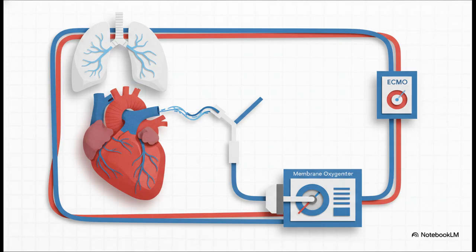In this hybrid setup, what we do is add a Y connector to our arterial return line and send some of that perfectly oxygenated blood back into the venous system. This essentially pre-oxygenates the blood that's flowing through the patient's own heart and lungs. So now, the blood that's being ejected by the left ventricle is well oxygenated, and that completely resolves the differential hypoxia.